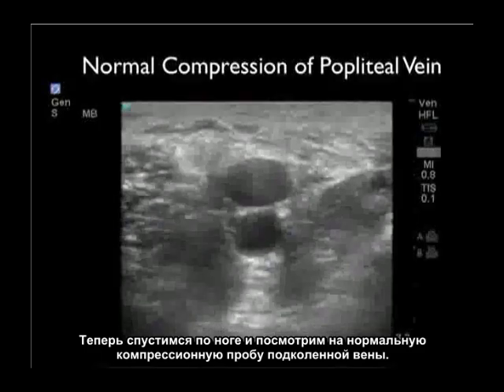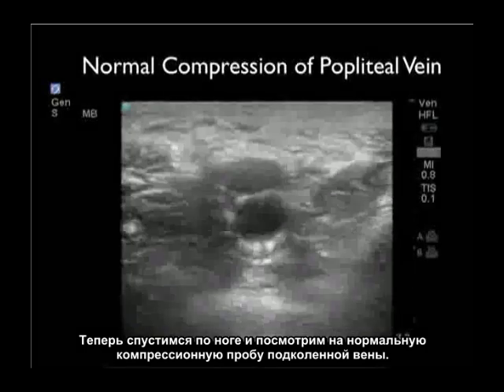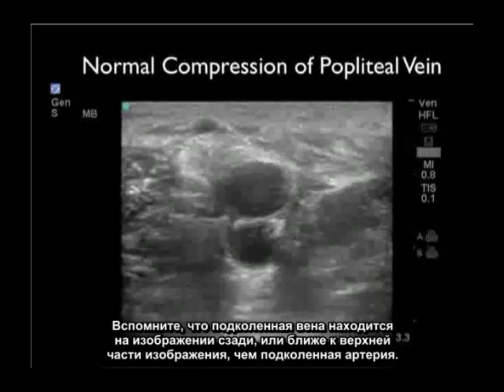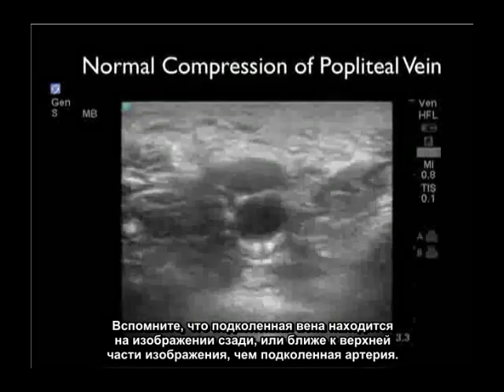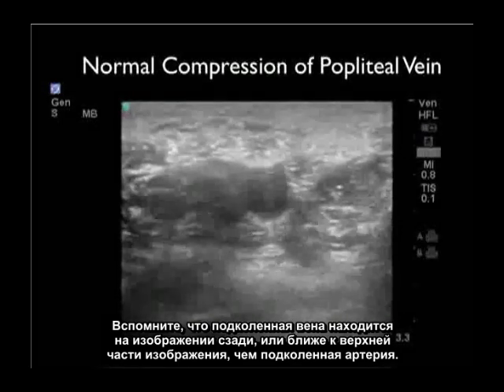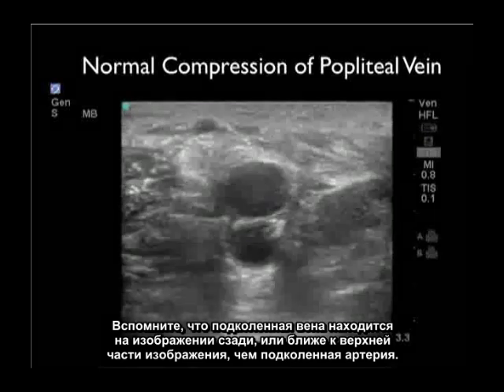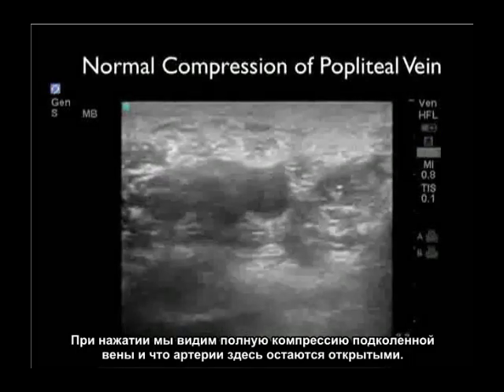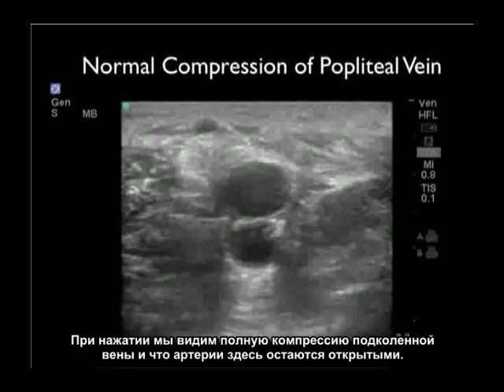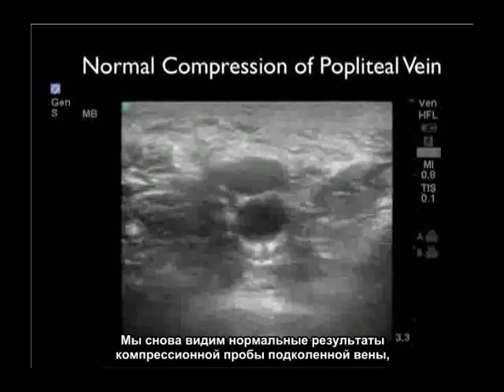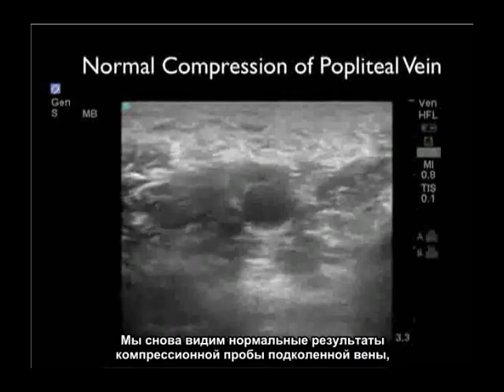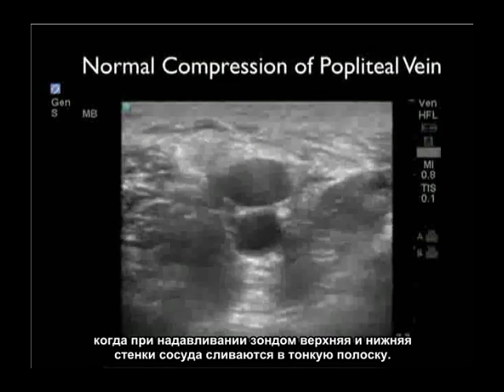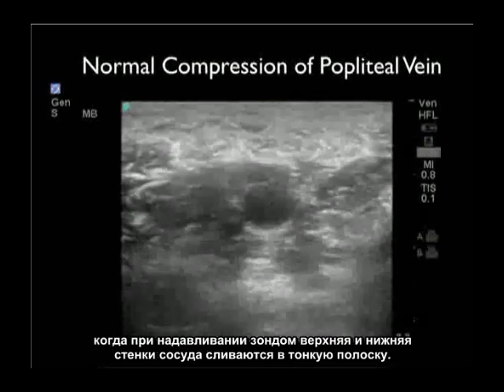Now let's move down to look at the normal compression exam of the popliteal vein. The popliteal vein is seen towards the posterior aspect of the image, closer to the top, compared to the popliteal artery. As we press down, we note complete compression of the popliteal vein while the artery stays open — a normal compression exam with the anterior and posterior walls of the vessel completely touching down with probe pressure.